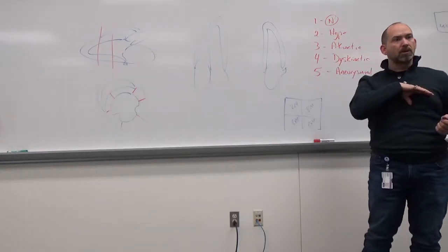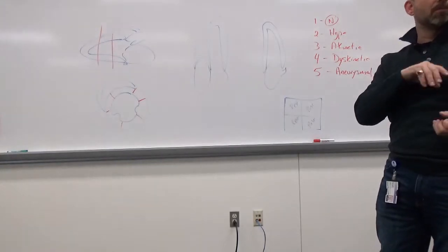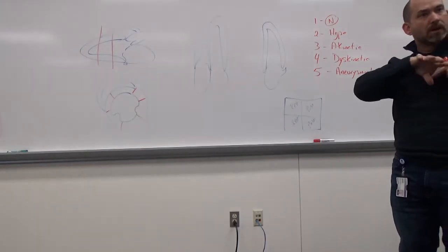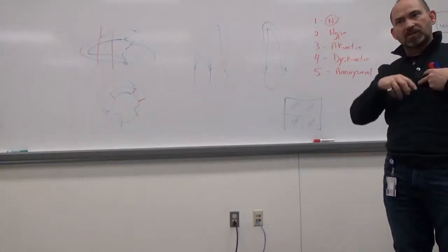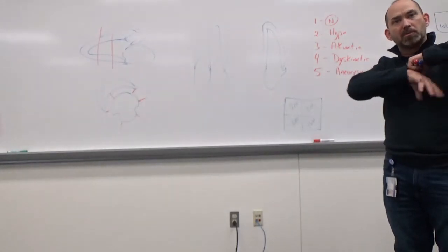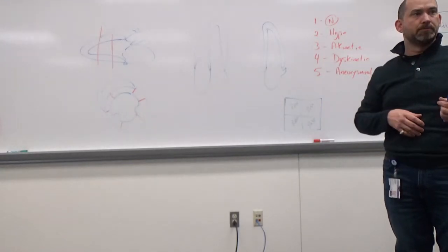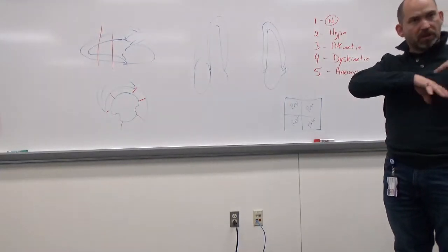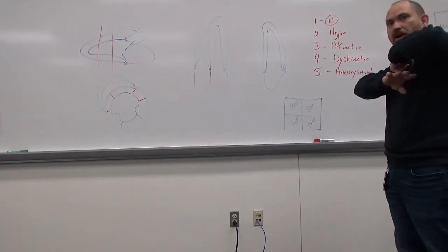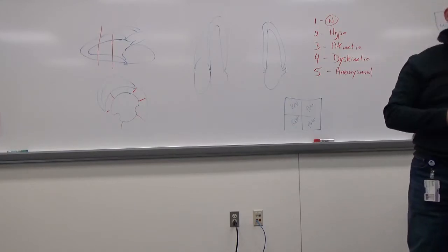Where is the heart anchored in the body? Where is it actually attached to something? The pulmonary veins, the back of the left atria. That's where it's anchored, and then the SVC and IVC. So that area up top here is where it's anchored. Everything else is movable. So what happens when you're breathing fast and heavy? The heart's moving, and it's not moving straight up and down or side to side. It's swinging like this because it's pivoting off this point. So my stress echo windows change after stress.